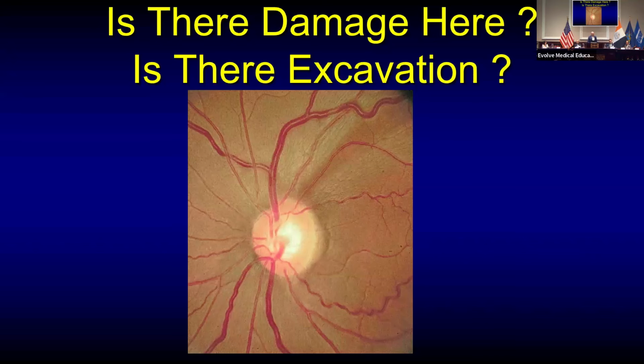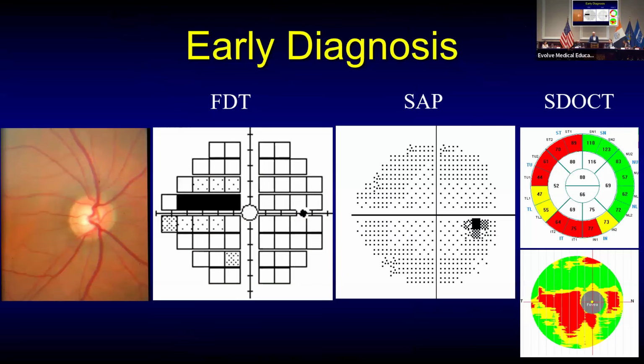Like in this particular eye, the optic nerve is rather small. The vertical diameter is smaller than 1.8 millimeters, so a rather small disc with a clearly defined retinal nerve fiber layer defect that all of us can see in this rather young individual. We know it's a real retinal nerve fiber layer defect. It's wider than a retinal vein. It is confluent with the edge of the optic nerve. I don't think any of us would miss that, but is this glaucoma? Of course it is. The nerve is rather small. There's no appreciable cupping. There's no focal loss in the integrity of the neural rim, but this is glaucoma, and now it's great to have objective technology to help detect and monitor changes in these patients over time.